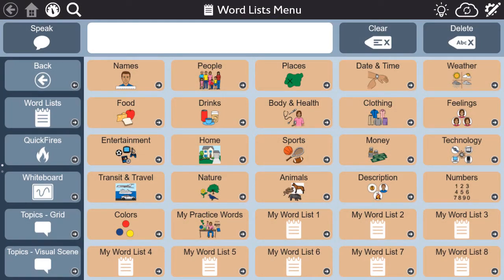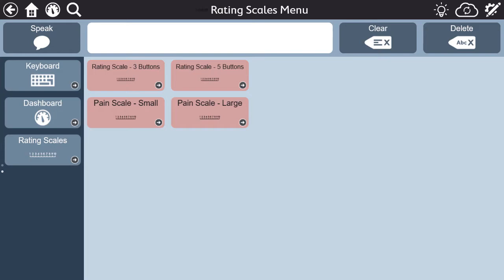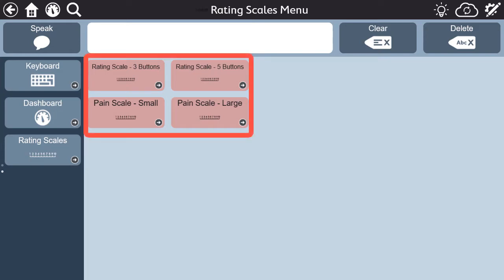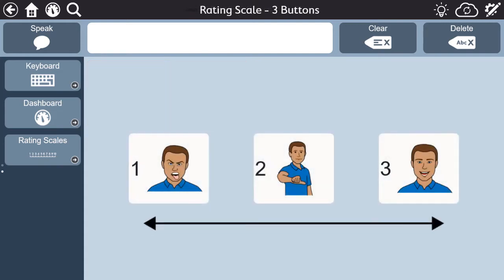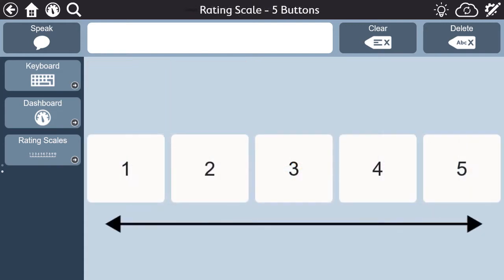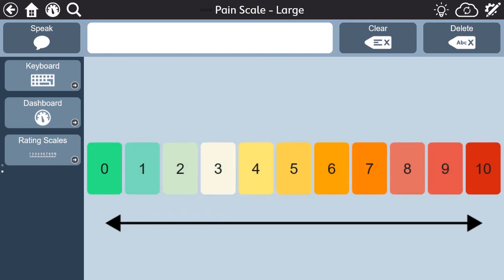You can access the rating scales from the toolbar of the aphasia pages in Snapcore First, where you will see there are four rating scales provided. The one you choose to use will depend on the needs of the person with aphasia with whom you are communicating. Consider size, color, and complexity when deciding which one to use in your conversation.